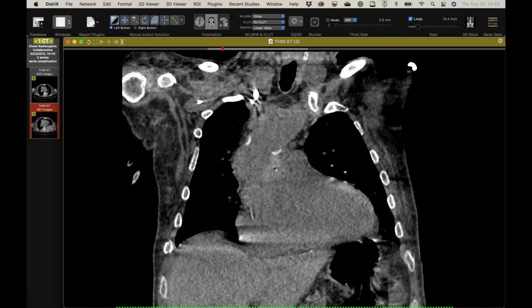Well, this was done for his pleural effusion, but he did have a CT angio like a couple days later that didn't show anything. No active bleeding. It just showed it stable. So they're going to watch it. So Jeff, it wasn't symptomatic per se. The repeat CT was because of pleural effusion.